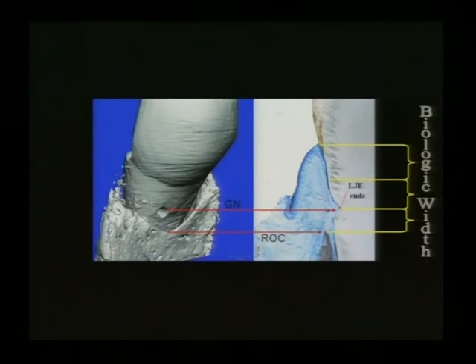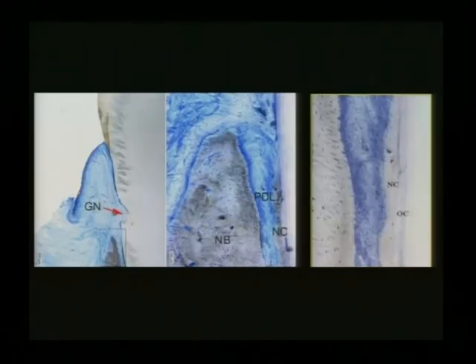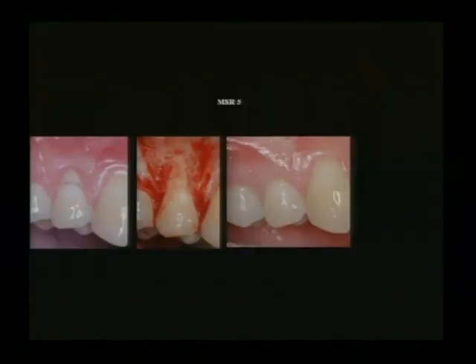And if we look at it in high power at this area right here, again, here's your PDL, new cementum, new bone. Here's our dentin, old cementum, new cementum, Sharpey's fibers, PDL, new bone. Another one, PDGF, new cementum, functionally oriented PDL. Look at those Sharpey's fibers. I mean, you're not going to peel this sucker off of there. Polarized light microscopy: bone, functionally oriented PDL, new cementum.